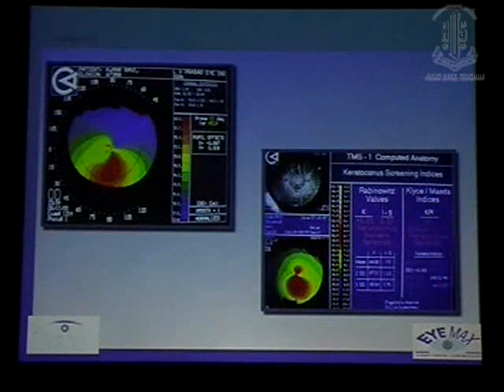The major use of topography, as we know, is in detecting ectatic disorders like keratoconus. If we are using a placido-based technology, we will find in case of keratoconus either an asymmetric astigmatism or inferior steepening of the cone, which is very characteristic. And whenever there is doubt, we take the help of indices like the inferior-superior index or center-surround index, or the skewing of the radial axis, with which it can give us definitive and objective information whether the patient is having keratoconus or not.